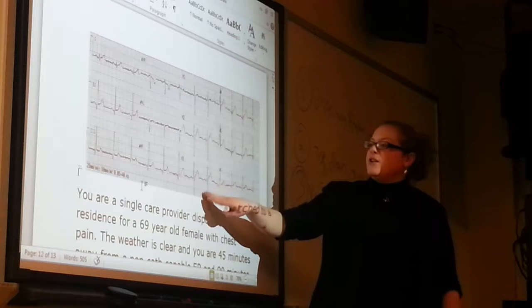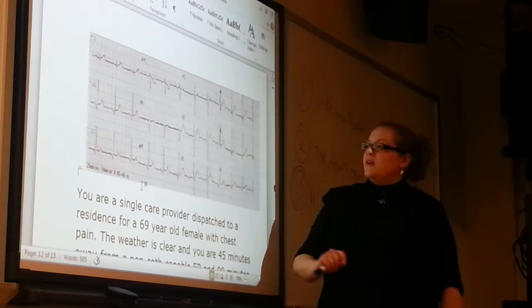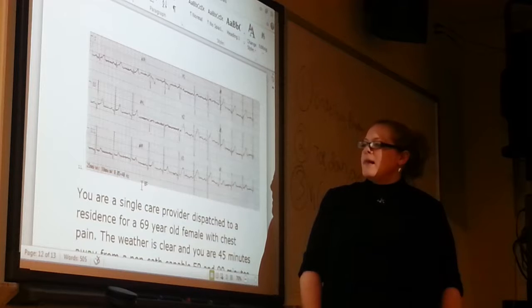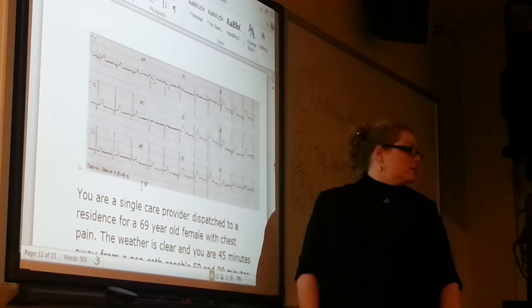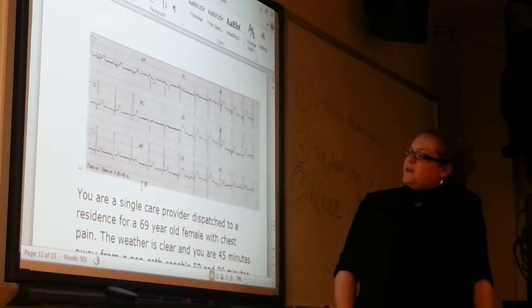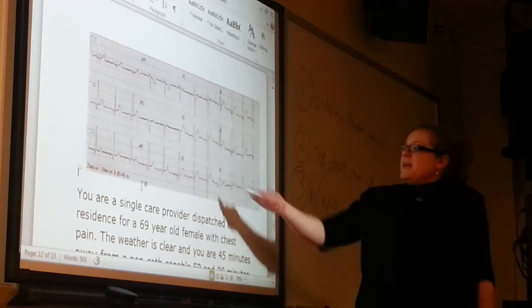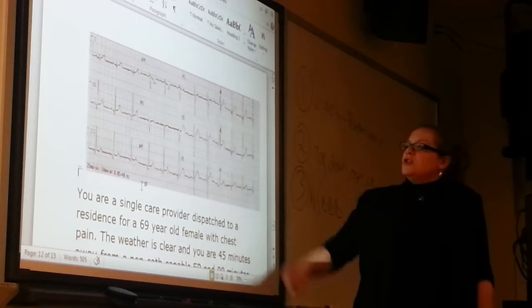All right, we're down here to V3. Let's start looking at lead V3. Anything significant in V3? What's going on with our T waves? We're totally peaked. Okay. Absolutely. Any ST segment elevation? Not really. Just peaked T waves at this point, right? I would agree with that. Everyone good?